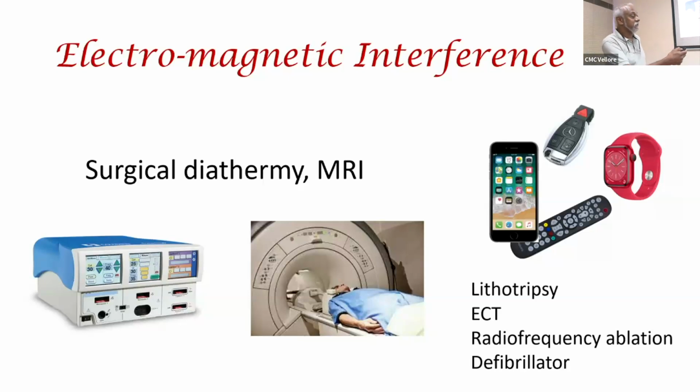Don't forget these things, which are always there when you're inside an operating room. It may be in the fancy watch or a car battery. All of them emit some kind of EMI or radio frequency. And not only that, you can even think of surgeries where there's electrical activity that can interfere with your pacemaker. So that is the worry.